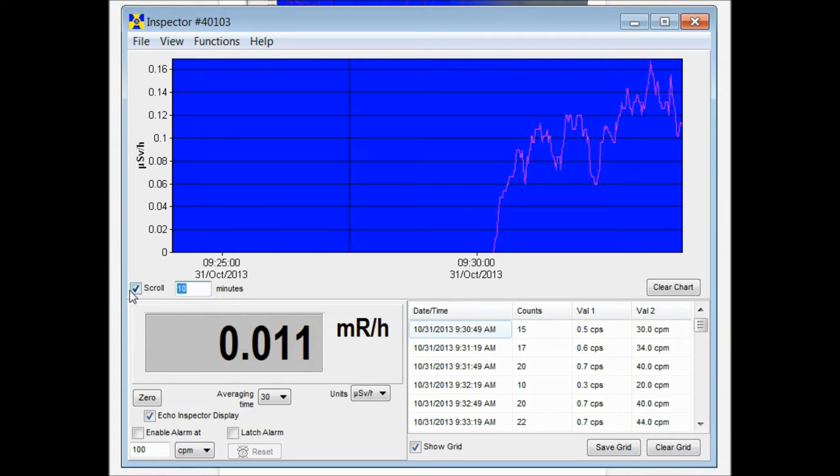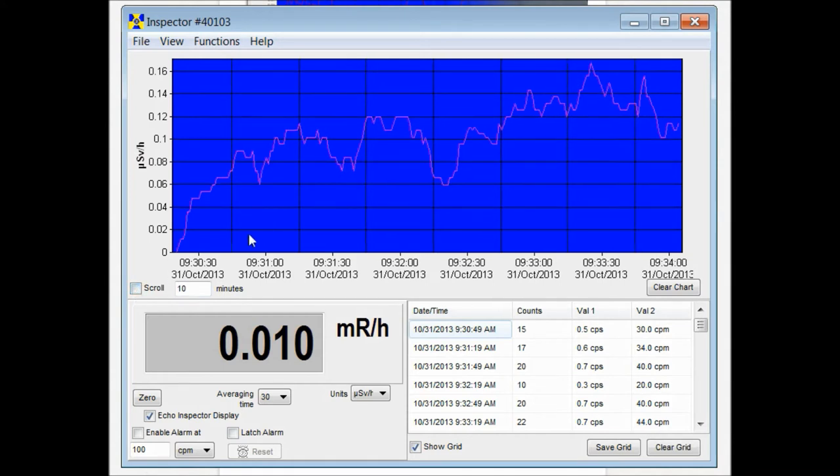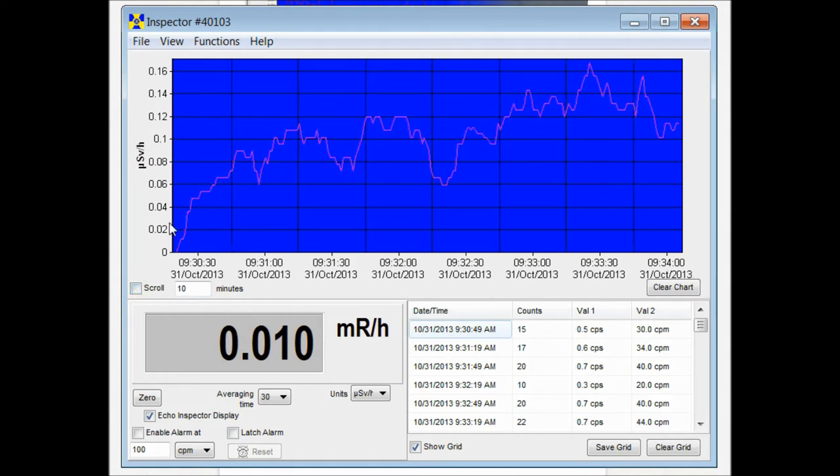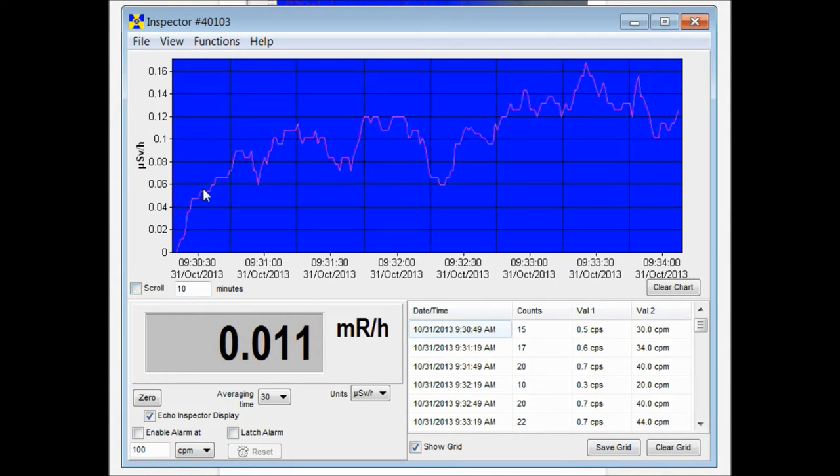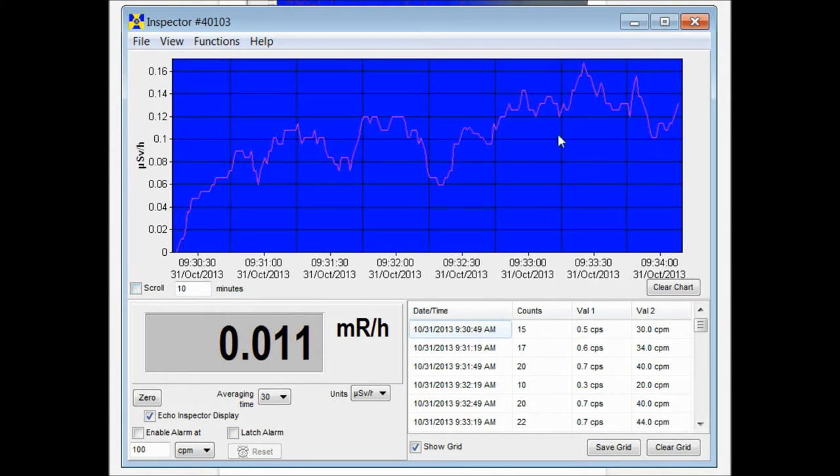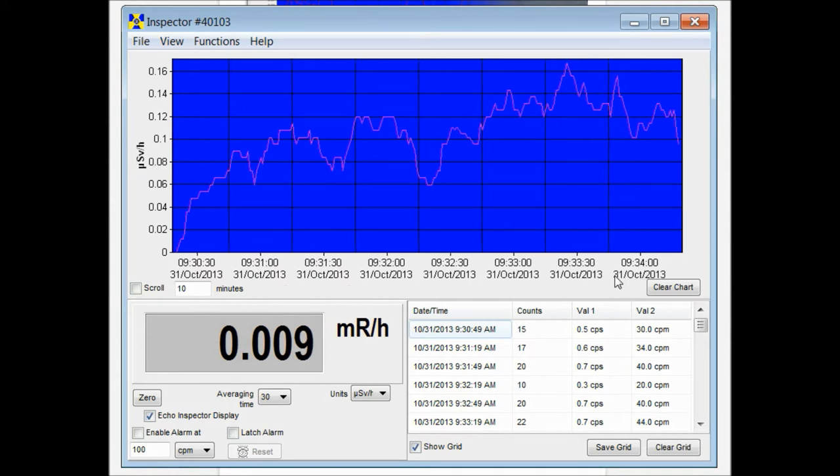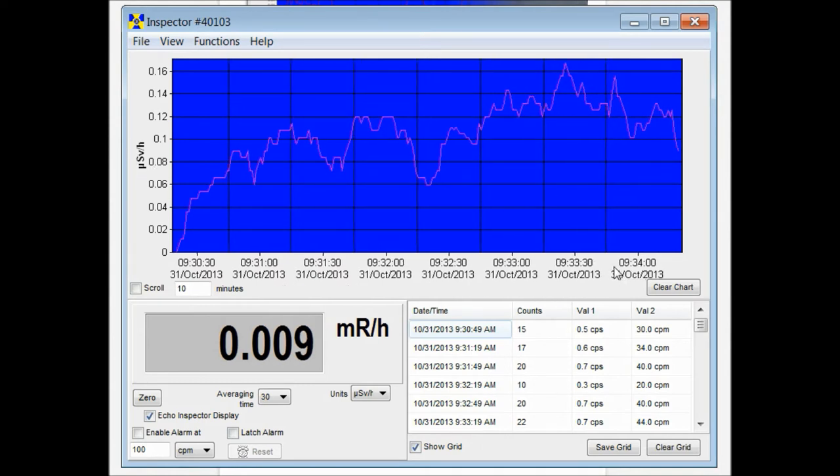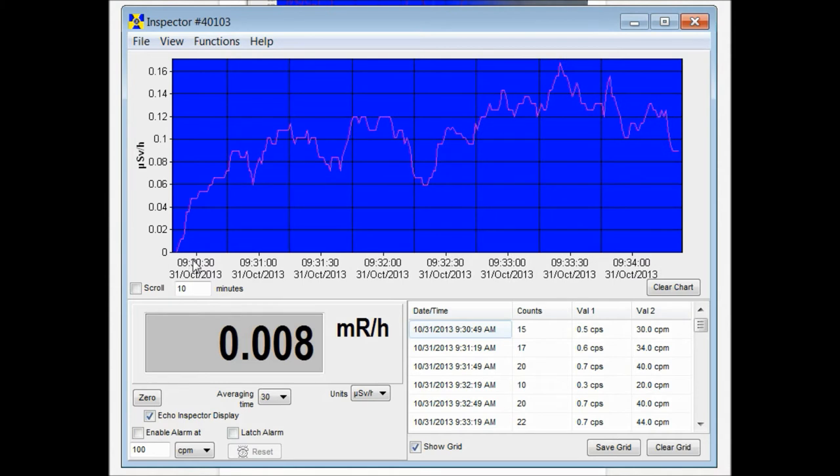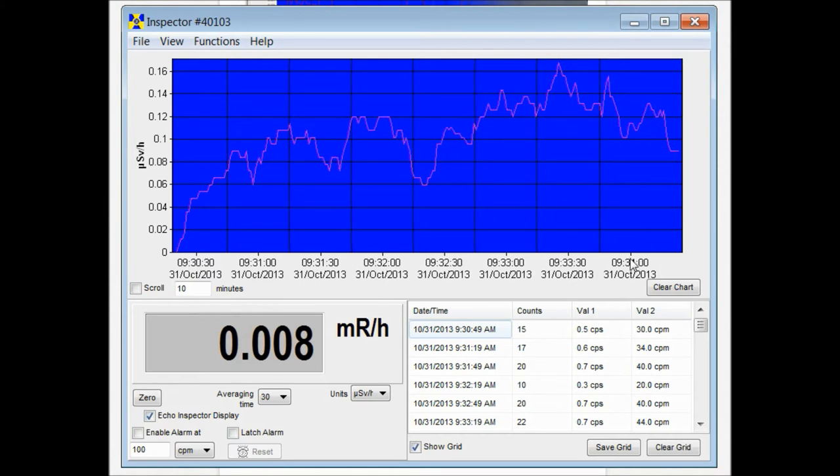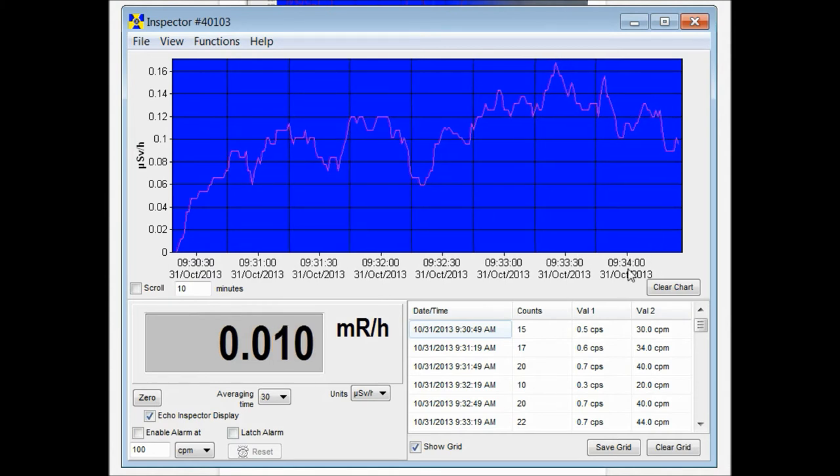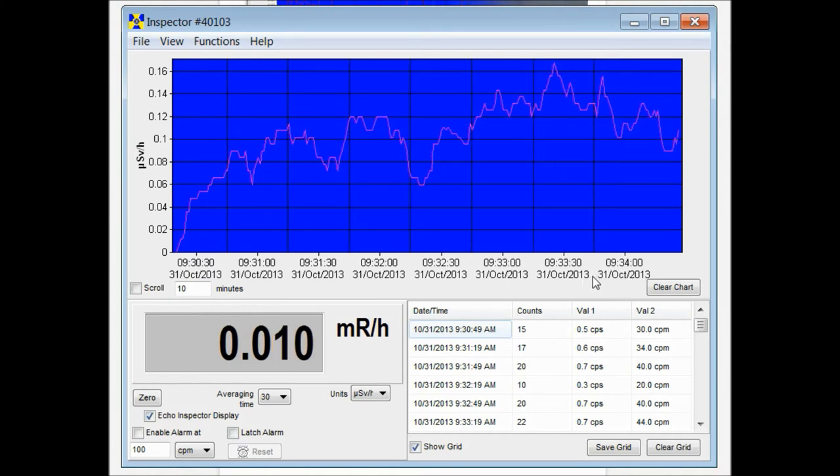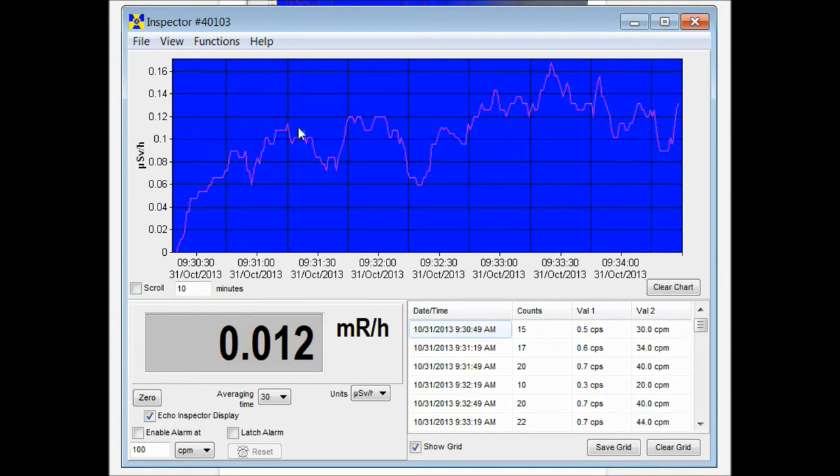So if we don't want it to scroll at all, the window will size depending on how long the count is. So right here we've been plugged in from a little before 9.30 to a little bit after 9.34. It time and dates everything for you.